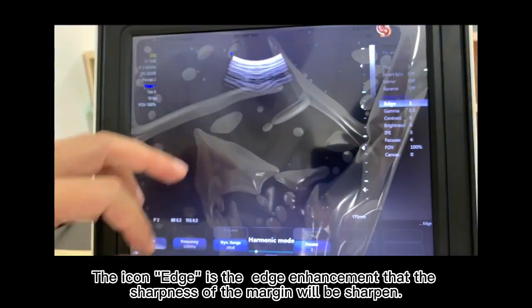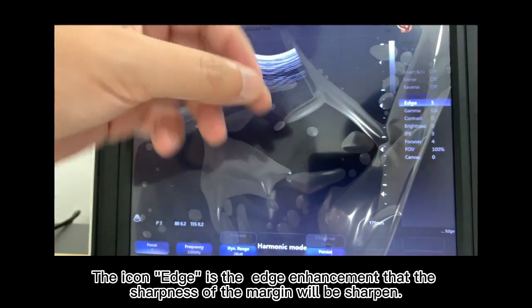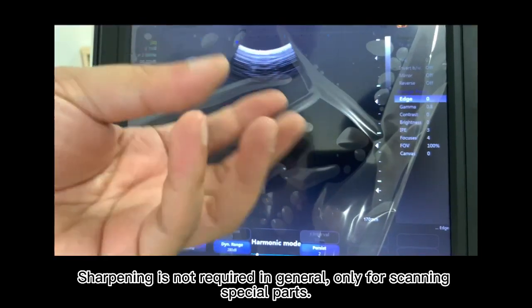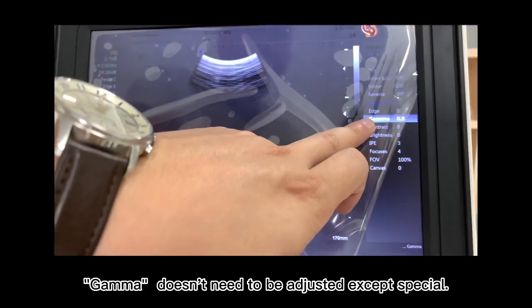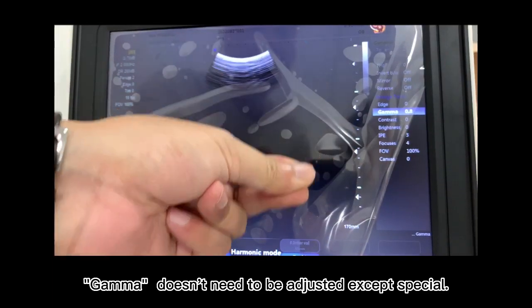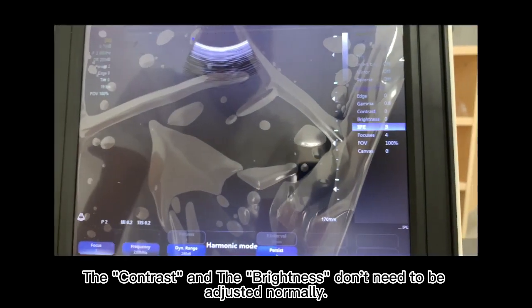The icon edge is the edge enhancement, by which the sharpness of the margin will be sharpened. Sharpening is not required in general, only for scanning special parts. Gamma doesn't need to be adjusted except in special cases. The contrast and the brightness don't need to be adjusted normally.